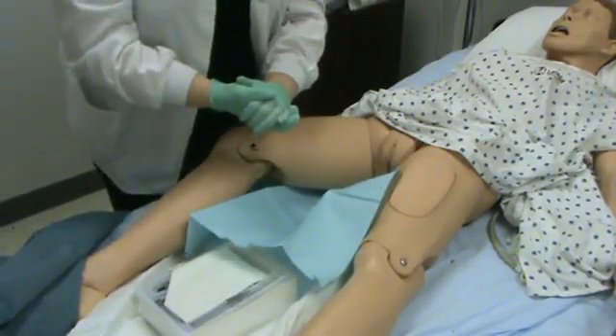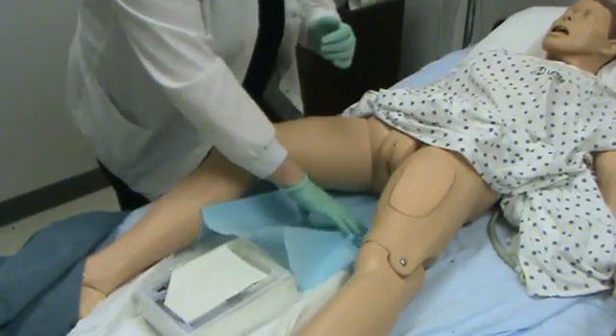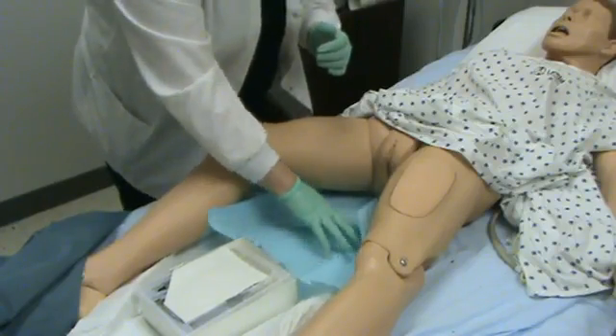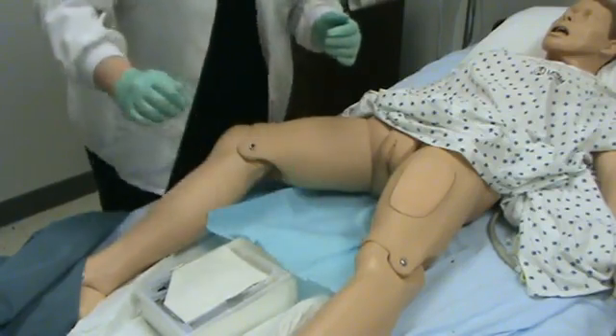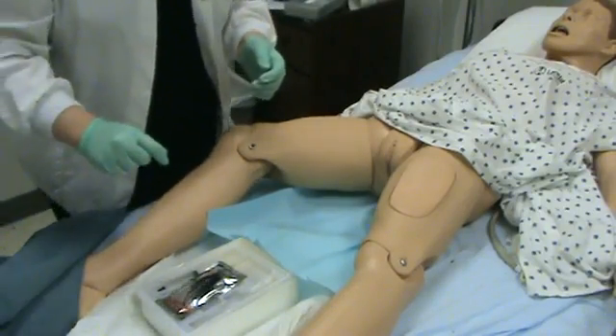Now that my hands have my sterile gloves on, I can take and position the sterile drape here as best I can without contaminating my hands. This is a fenestrated drape — we do not use that so I am going to throw that into the garbage can.